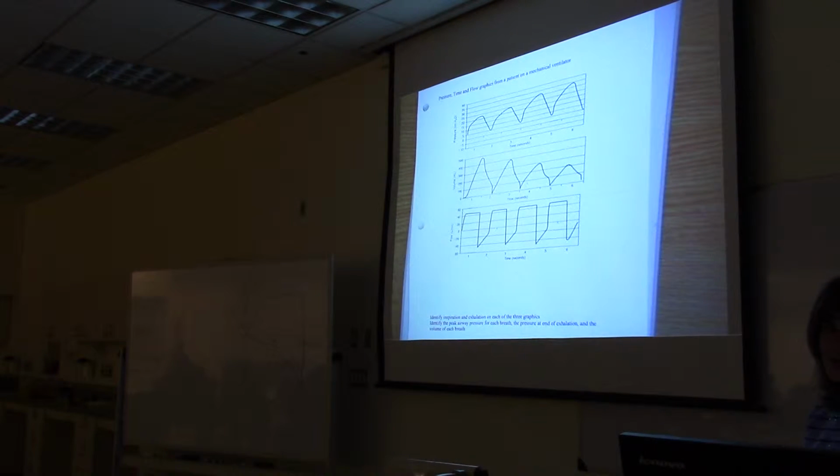Right, so I gave you this handout, and on the first page, it wants you to identify inspiration and exhalation on each of the 3 graphics.